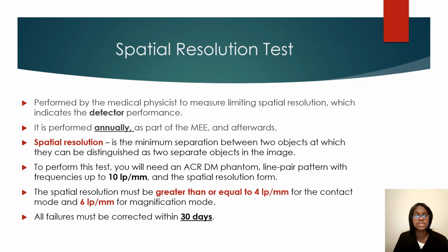For your spatial resolution test, another test that is performed by the medical physicist, this is going to measure the limiting spatial resolution, which indicates the detector performance. It is performed annually as part of the MEE and afterwards.